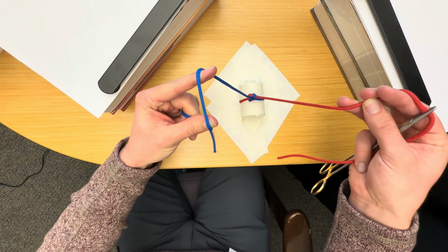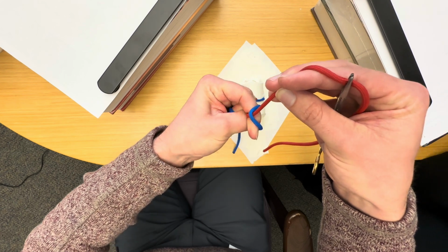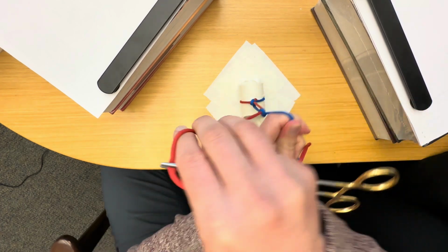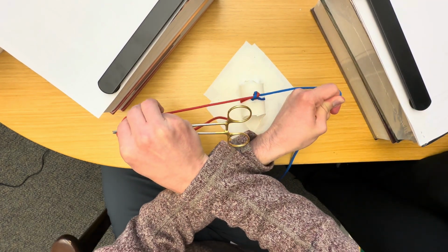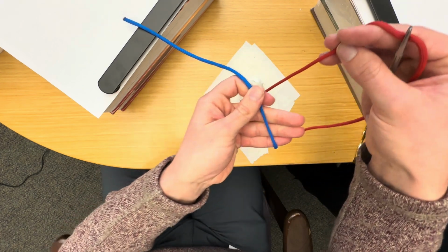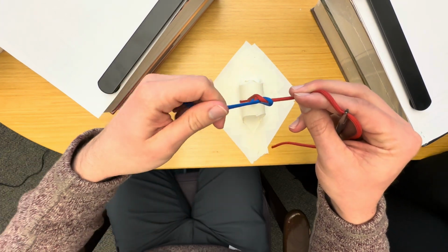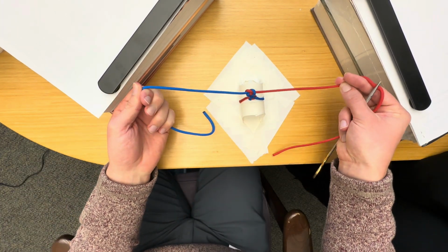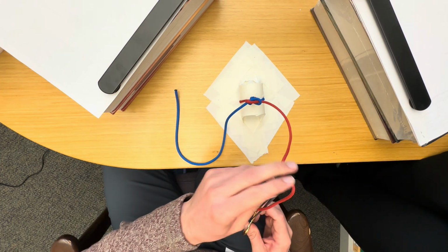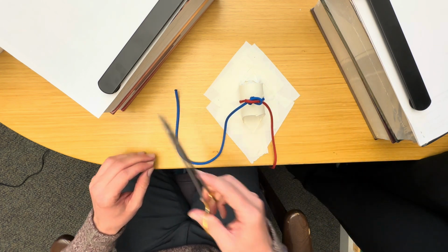So we have it over our thumb and forefinger. We bring the needle with the needle driver in the middle there, and with our index finger come through, grab it, and then rotate to where you have the same tension there. We go back to our karate chop. We bring it over our three fingers, take our middle finger, grab the string, and pull it down flat like that. So that's probably the most common way that you're going to do it, because you're usually throwing it with your right hand over to the left, and then you cross.